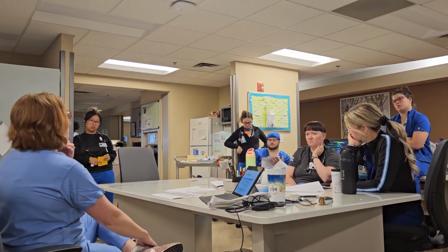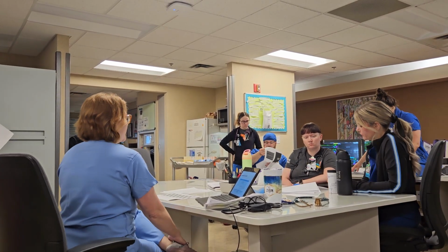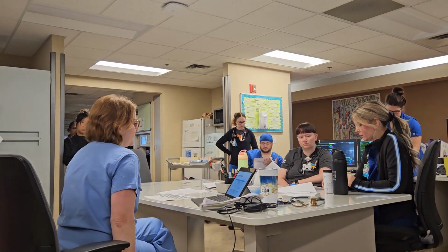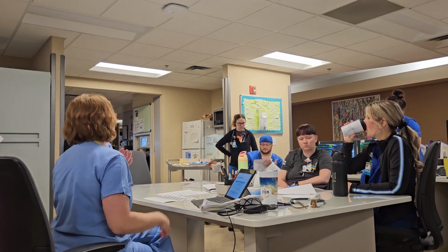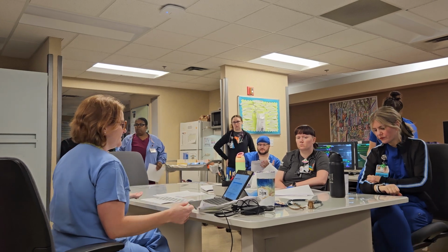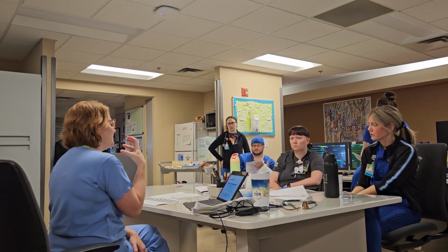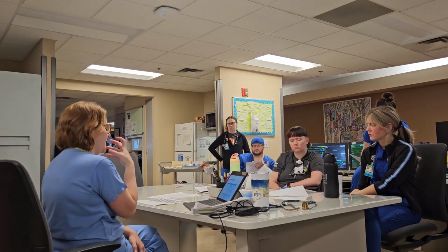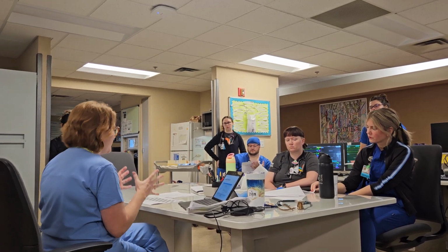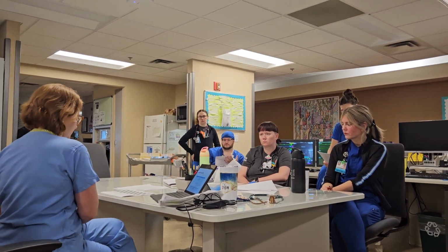A little bit next on non-invasive ventilation, because it's really important, we use it a lot. The first one is CPAP, continuous positive airway pressure. This is essentially just what we just talked about, which is PEEP. PEEP and CPAP are basically the same thing. CPAP is an external, non-invasive ventilation mask put on the face with continuous positive pressure. It's best for people who are hypoxic, have primary hypoxic issues. It doesn't fix ventilation, it fixes oxygenation.